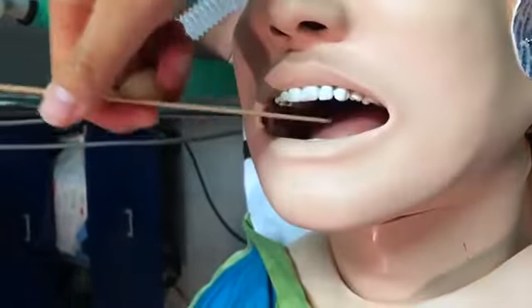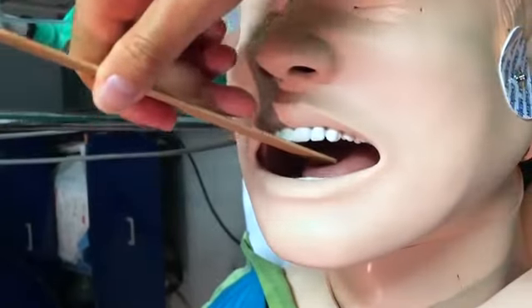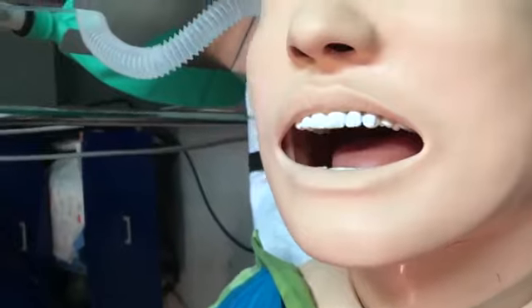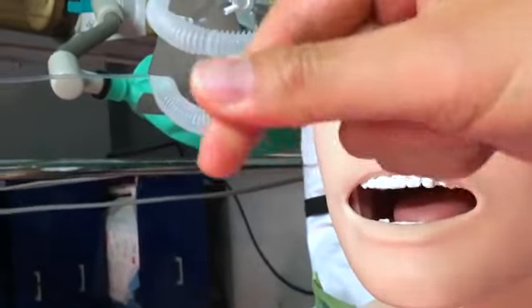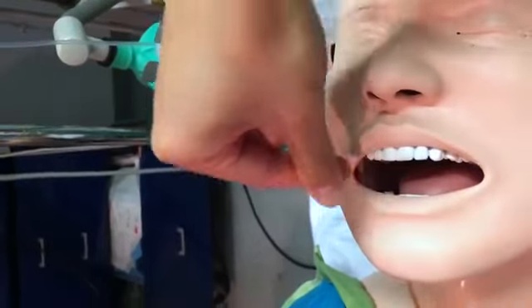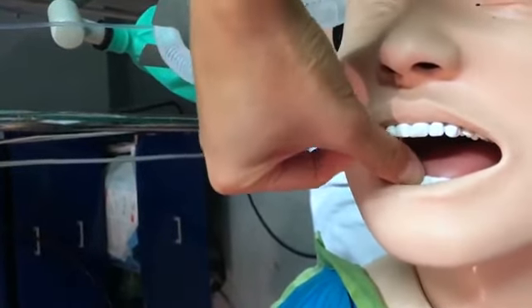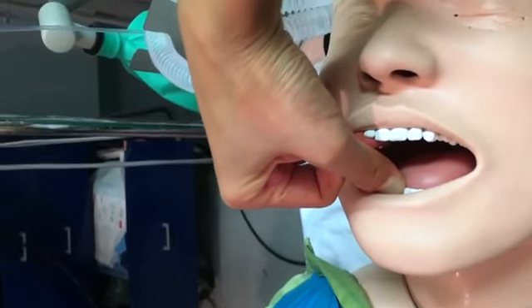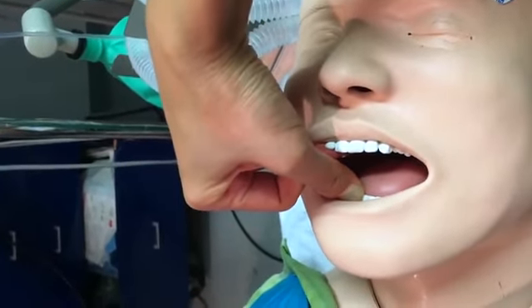Usually the tongue is a big obstruction in a lot of the airway management that we do. So you can use the tongue blade to move the tongue out of the way, or you can do something called a scissoring technique, which essentially you make like a heart symbol with your fingers, and you increase it. So you can scissor like this, allowing for more space for the oral airway to go in.